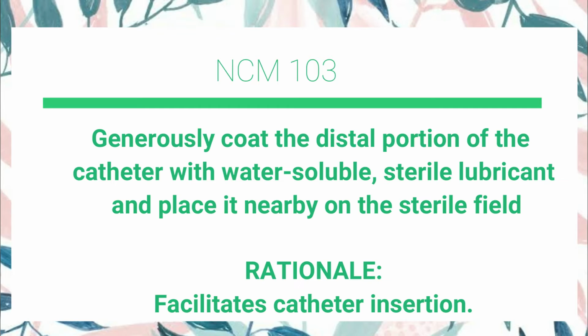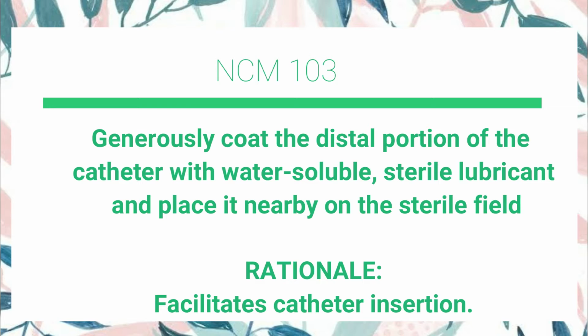Generously coat the distal portion of the catheter with the water-soluble sterile lubricant and place it nearby on the sterile field. It facilitates catheter insertion.